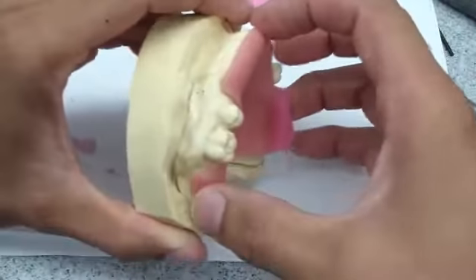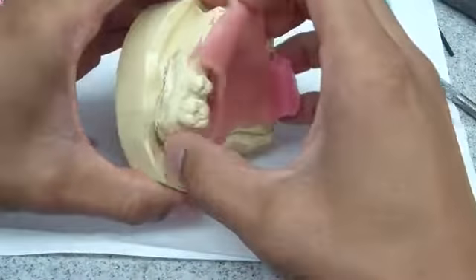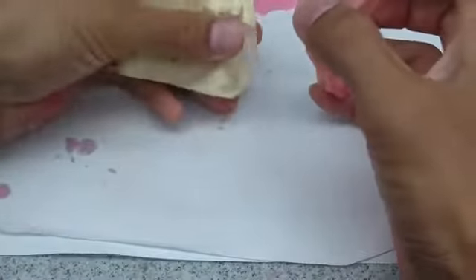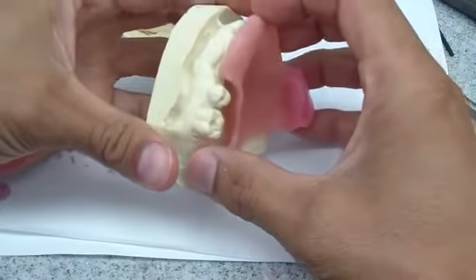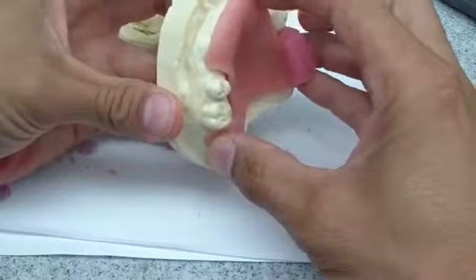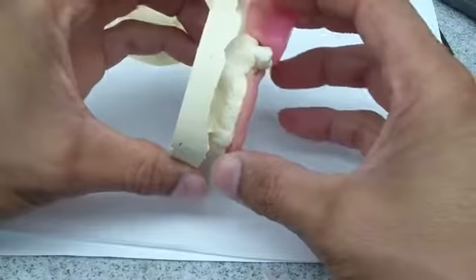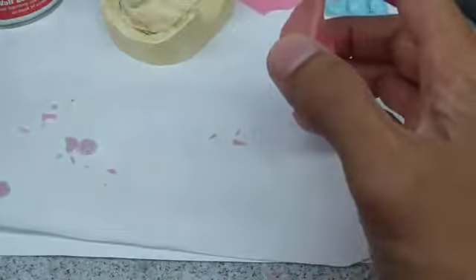So I fabricated, and not in this situation, I've now learned, fabricated the denture base, we saw. Now here's the original diagnostic impression, and you see it just will not fit. It's going to rock. I could, I suppose, grind that in. So that's another food for thought.